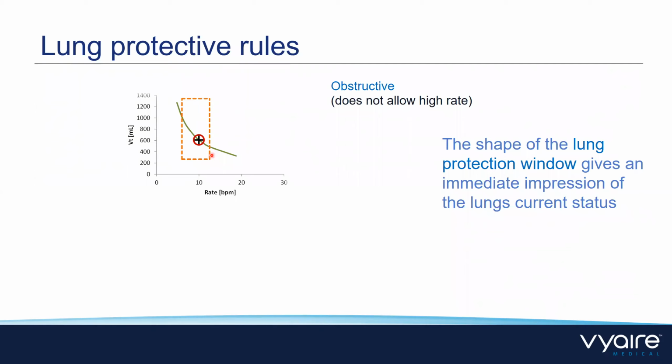And if you see a protection frame shaped like this, you already know by entering the bedside this patient has an obstructive problem. We can't say exactly what the problem is, but you know by looking at that protection frame there must be an obstructive problem.